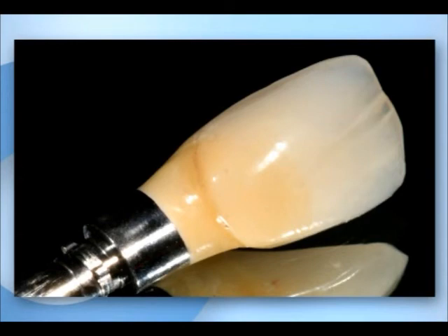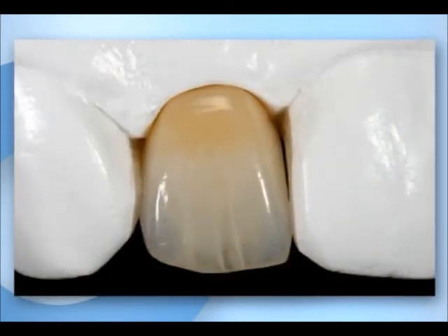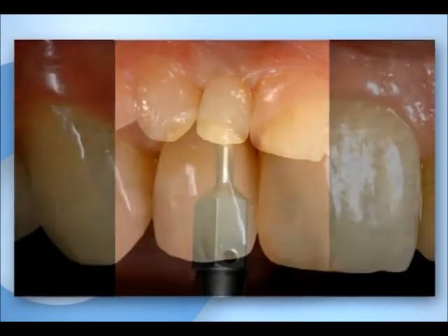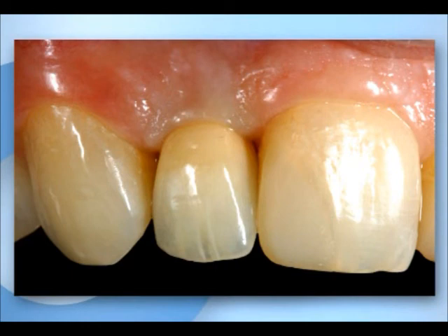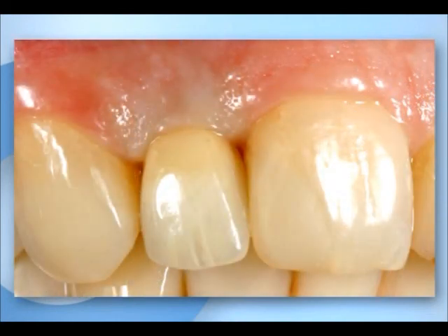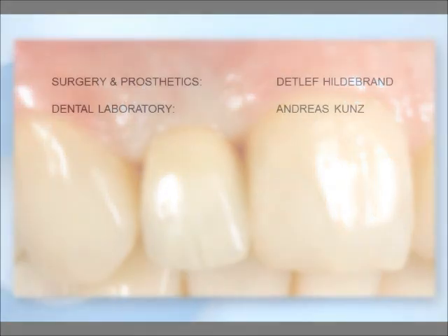After polishing, a final control of the crown on the master cast is done. When the crown is inserted, the soft tissue becomes anemic. If the anemic zone does not return to normal after approximately five minutes, the contour of the crown has to be reduced. The soft tissue contour has adapted well after only a short time following the installation of the crown. The red and white appearance meets the aesthetic requirements.